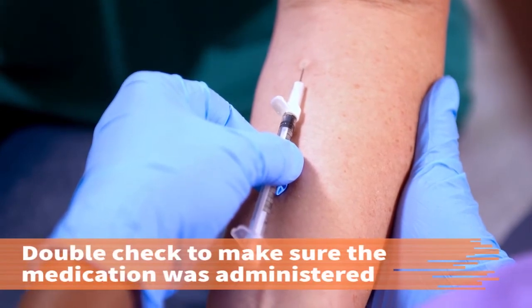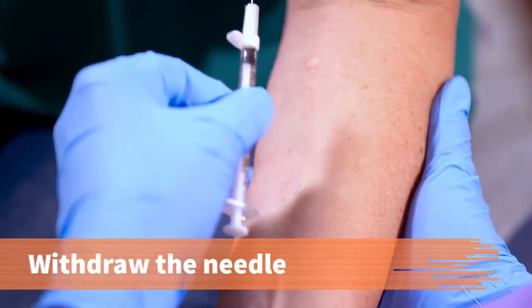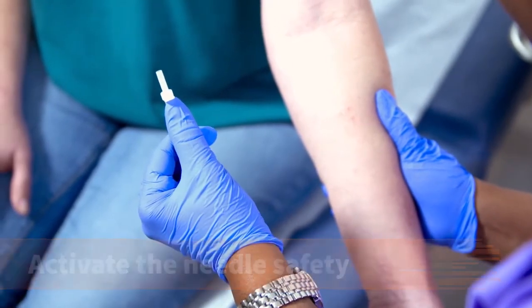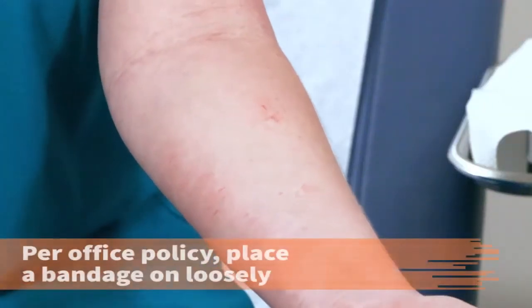Double-check the barrel of the syringe to make sure all of the medication was administered. Withdraw the needle. Activate the needle's safety device with one hand. Discard the needle and syringe in a biohazard sharps container. Make sure to put the needle in first. Do not massage the area.